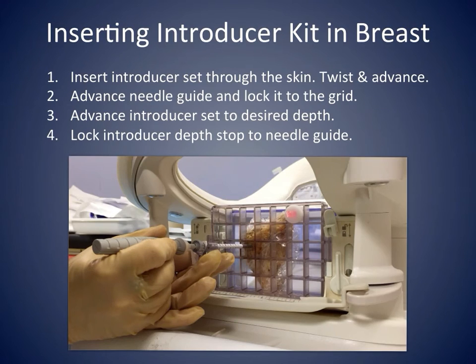We're now going to show you the steps to place the introducer kit at the desired location, from the first step of inserting and advancing the introducer kit inside the breast to the last step of locking the introducer depth stop to the needle guide.